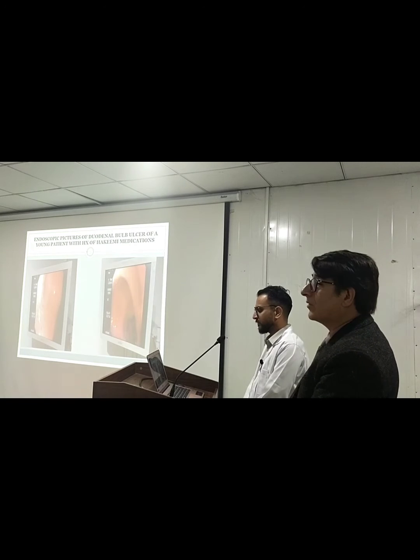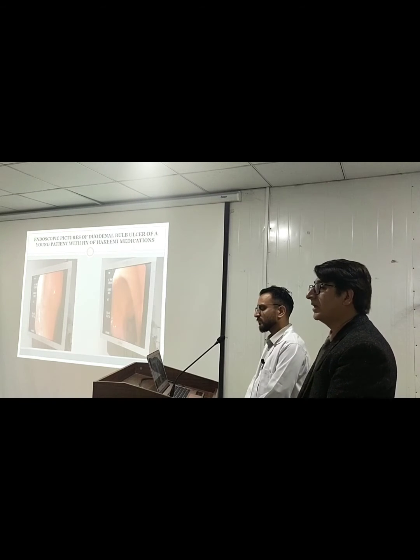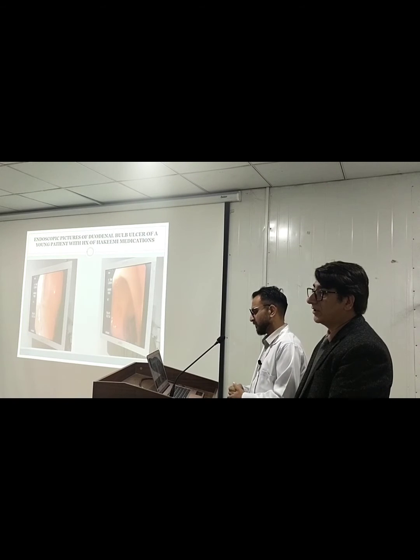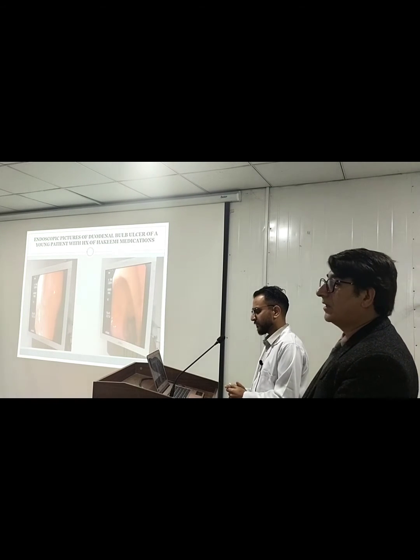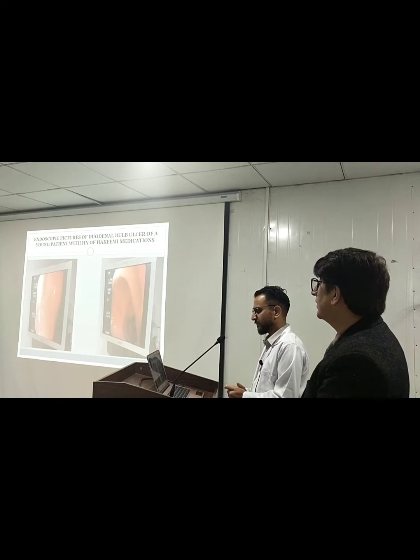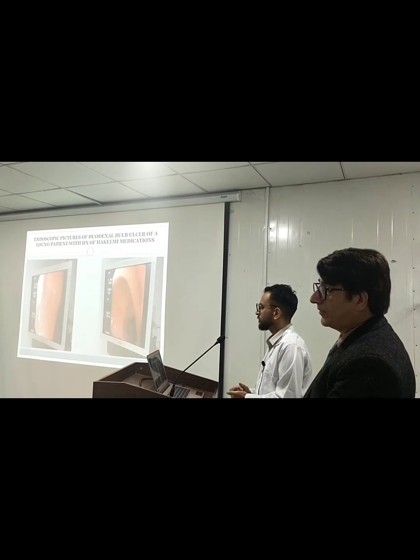But for those ulcers that are malignant, that look nasty, where the patient has really lost weight and is aged, the recommendation is to take the biopsy from the ulcer edges. So it varies from individual patient to patient to whom we take biopsies from and whom to spare. Sometimes we try to spare the patient if we have a clear cause of upper GI bleed and a clear cause of the ulcer. So that's why it depends on the individual patient.